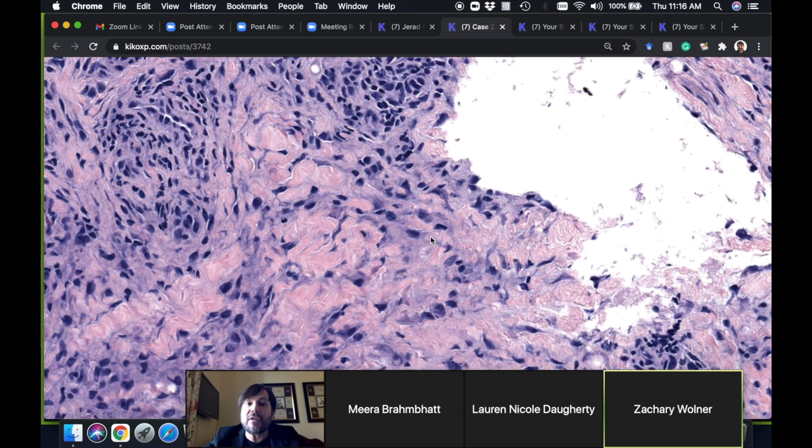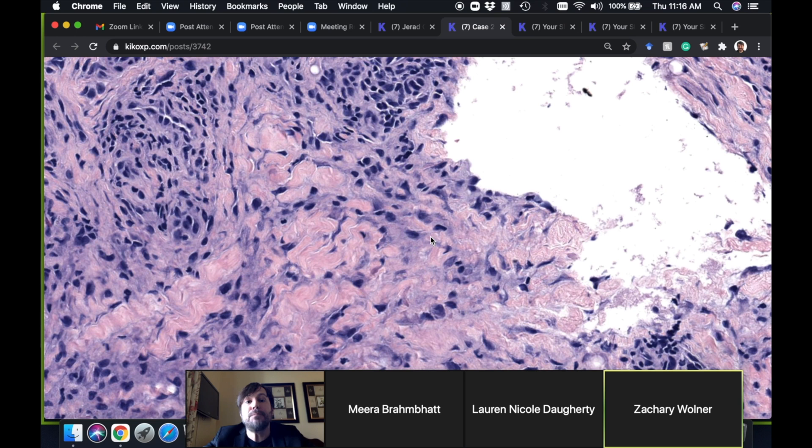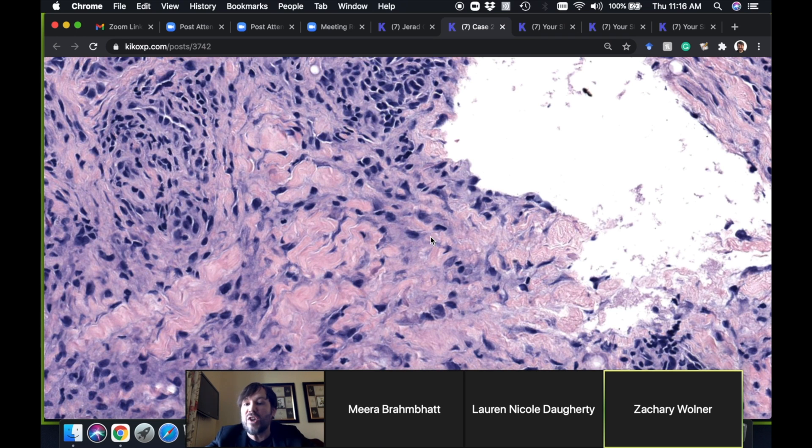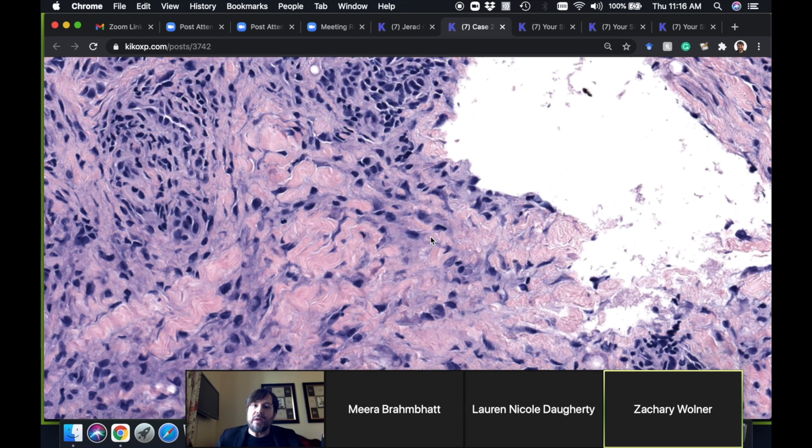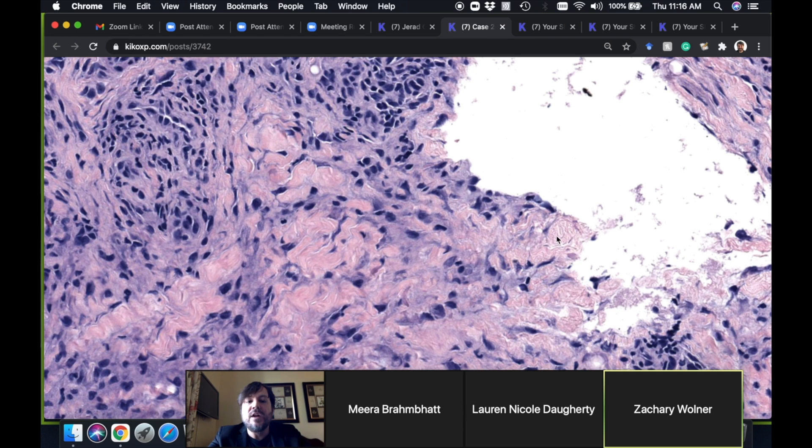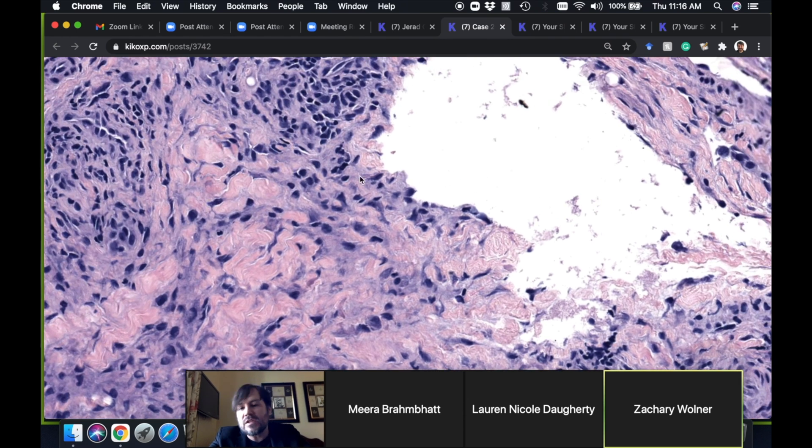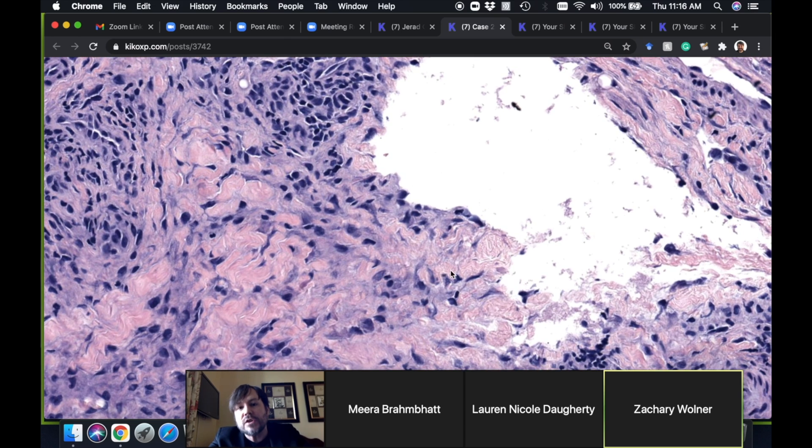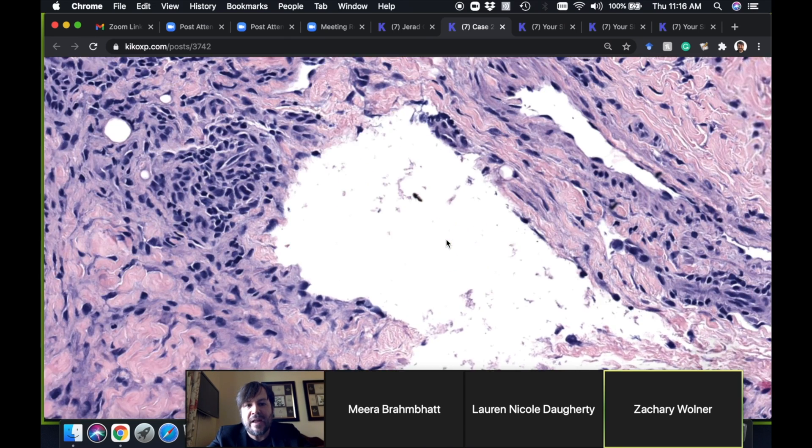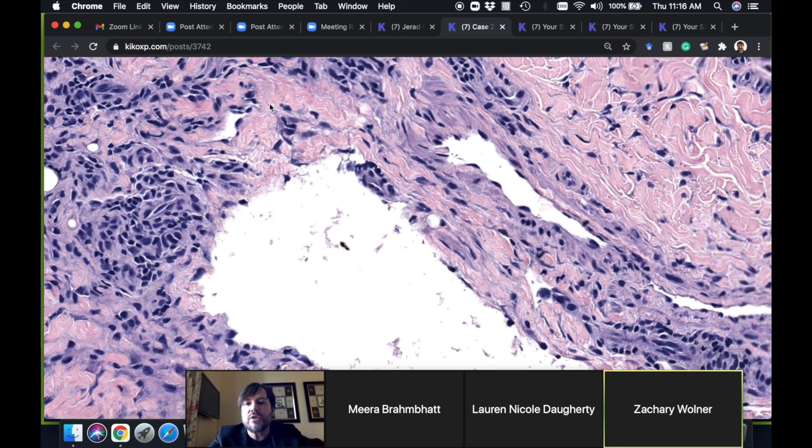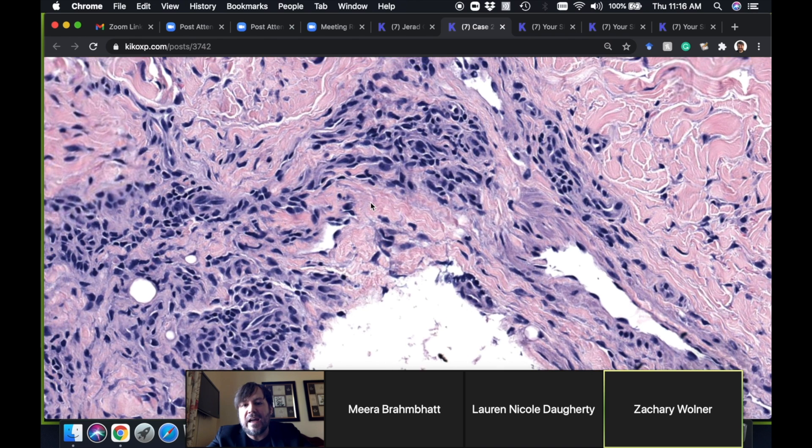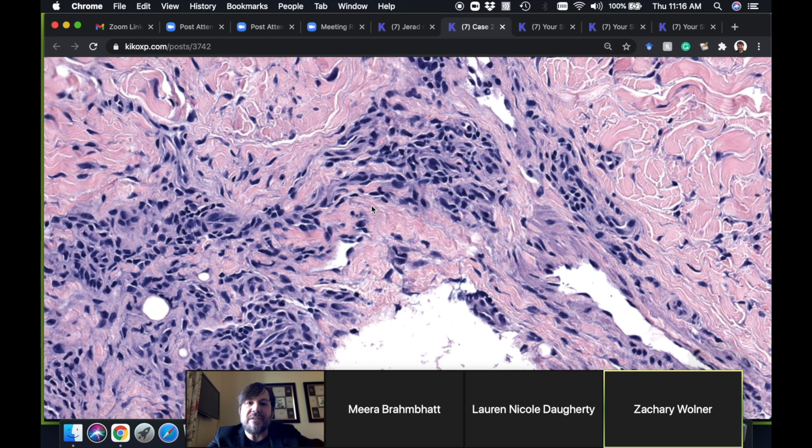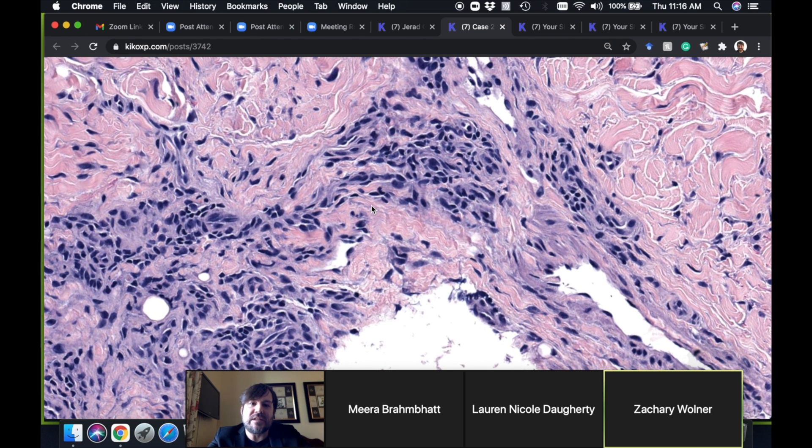Another thing that does that is blue nevus. When blue nevi lose their pigment they look a lot like dermatofibroma because they trickle between collagen at the edge. This is what we call the interstitial pattern of granuloma annulare. The interstitial pattern of GA—it's not some different disease, it's just a different pattern.